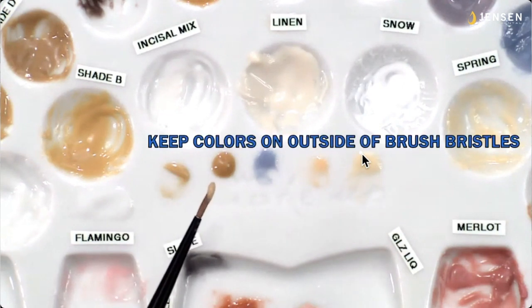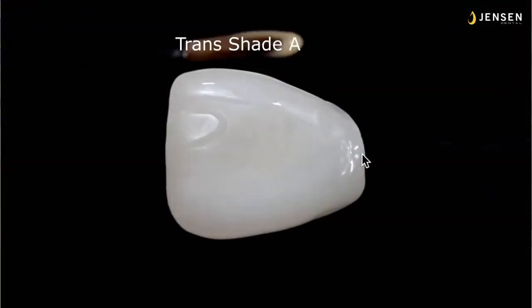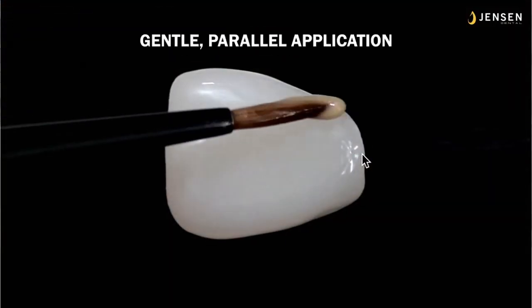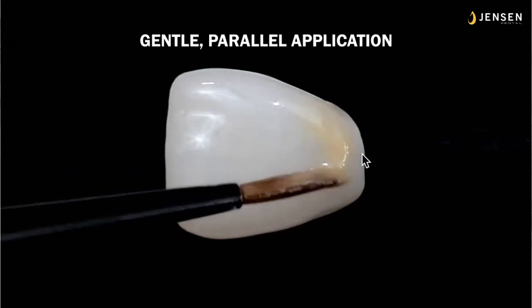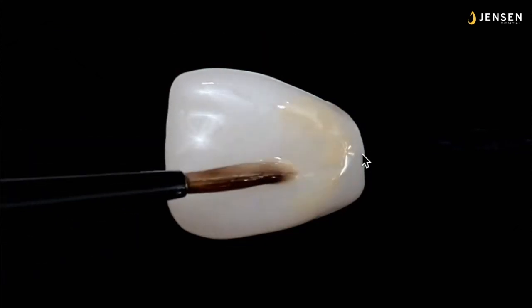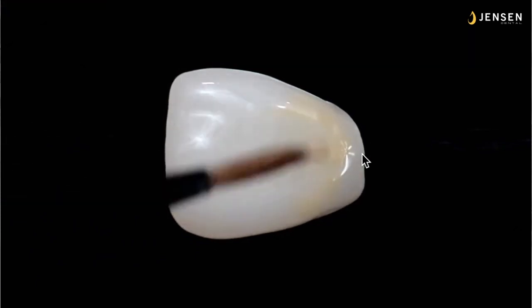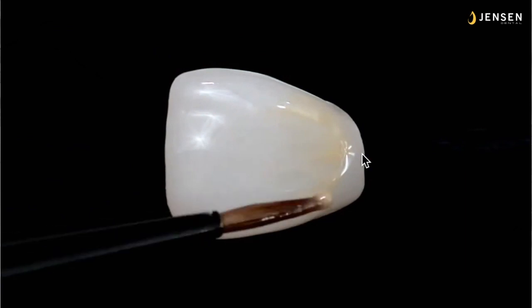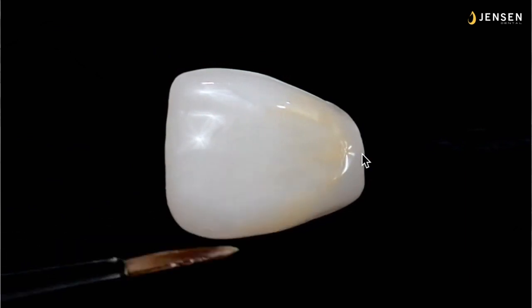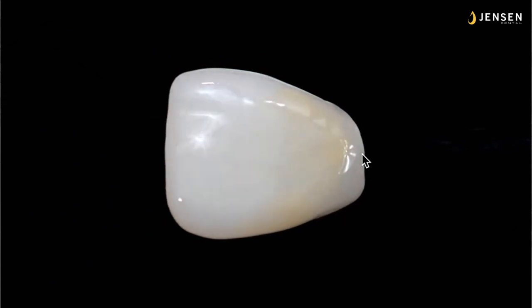And I want to swipe it so we keep the colors on the outside of the brush bristles. We don't want them inside or else it won't release. And we want to use a real nice, even, gentle application, and try to keep it as parallel as you can. Think about playing cards if you're sliding one playing card on top of another one. The more even you have it, the more gentle the stroke, and you're going to find it slides right off the brush, and it'll give you a nice gradient type effect where you can fade the colors in.